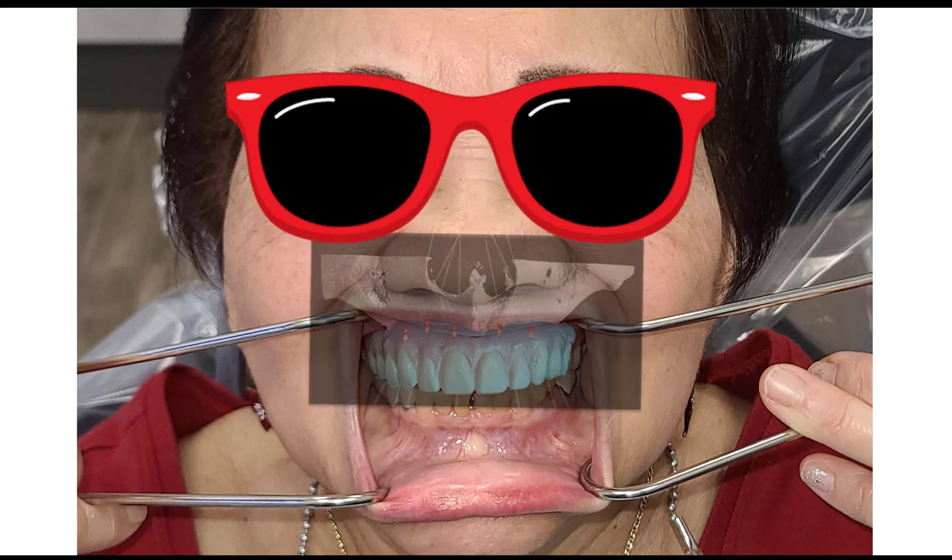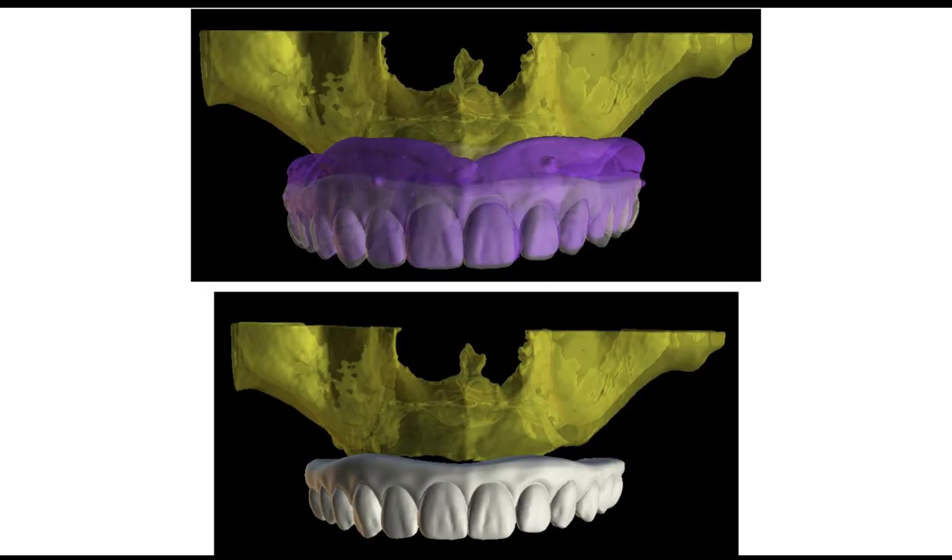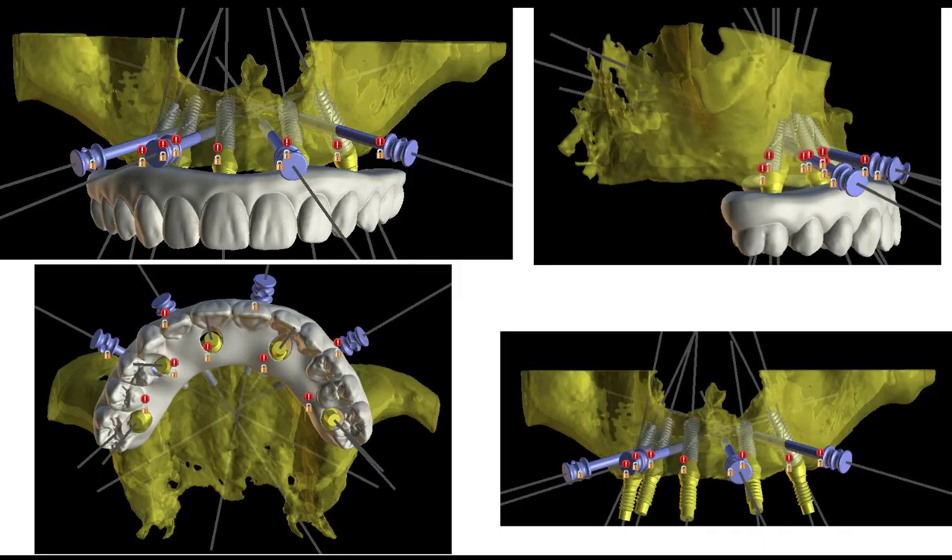So those are easy changes to make. I always like to do this transparent overlay with data from Blue Sky Plan to get myself oriented — it makes it much easier when doing the setup for the new teeth. In Blue Sky Plan, we start with bone segmentation since this is a bone-supported case. Then we bring in all our models and design the wax-up in the Blue Sky Denture module. The purple is her existing denture and the white is my new wax-up — very, very minor differences. On the patient's left side, I've brought the length of those teeth down to correct the cant, but aside from that, not a whole lot of changes were made.